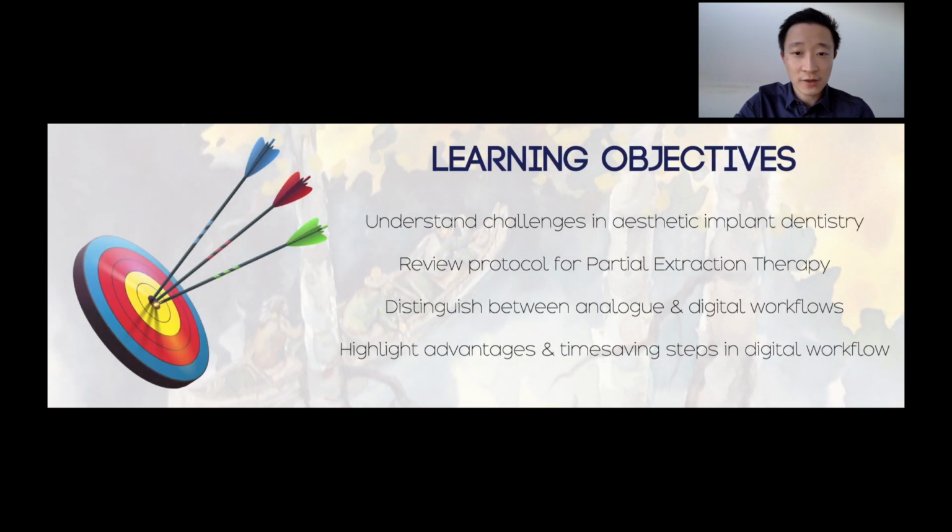Today's objectives are to understand challenges in aesthetic implant dentistry, to review quickly the protocol for partial extraction therapy, distinguish between an analog and digital workflow between the two cases, and highlight some of the advantages that the digital workflow has, as well as time-saving steps.